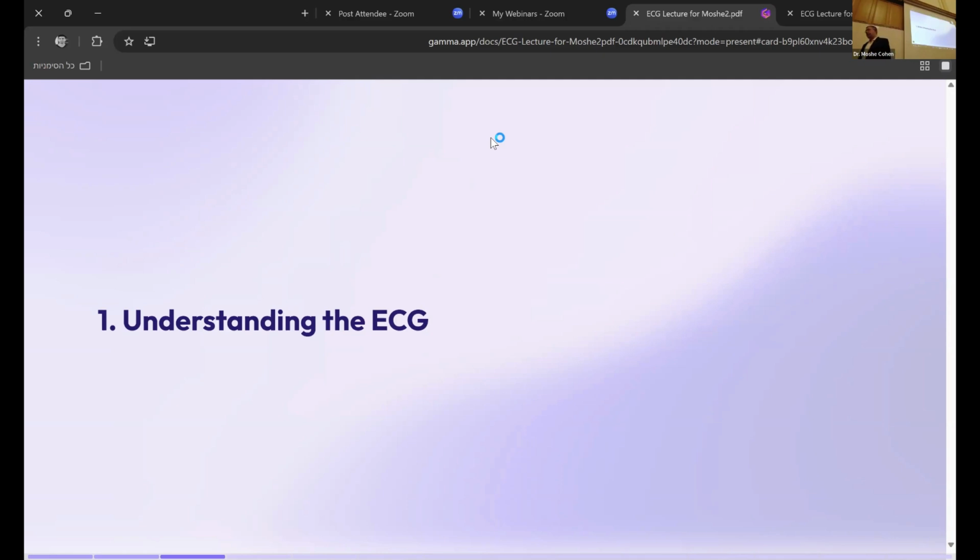Okay, so I think that this lecture may become very important as you come to the third year and afterwards fourth year, and especially when you later on see patients. ECG is electrocardiogram. It's a very common way, very cheap. It's found everywhere, in every emergency room, in every clinic, and it's the best way to quickly diagnose pathologies of the heart and to treat them accordingly.